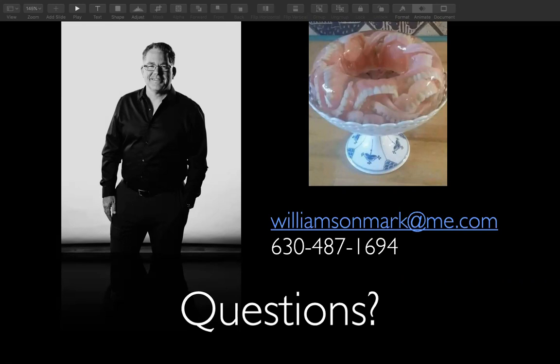Possibly, if we need to open the bite a little bit, we might do a digital or diagnostic setup, set some teeth in wax, do some sort of try-in to see if the patient is okay with that opening. Can we design our restoration around this VDO where the teeth are positioned? If not, then we're trying to come up with something, maybe a Montreal bar, that's a metal, highly polished substructure. And then maybe I process the teeth in acrylic on top of it. Possibly I've been able to do that.